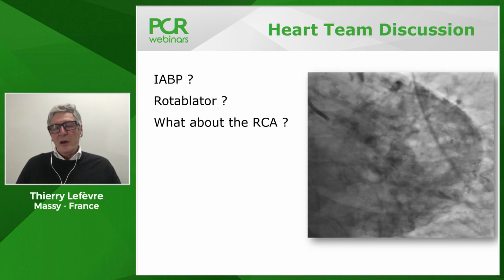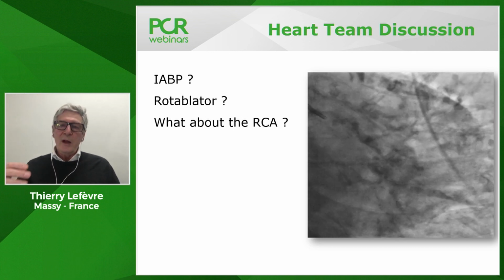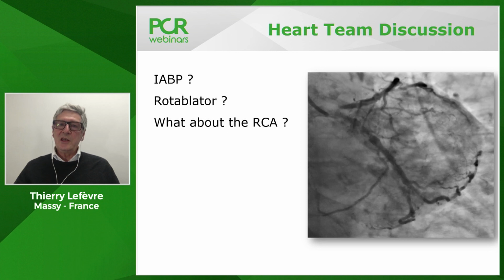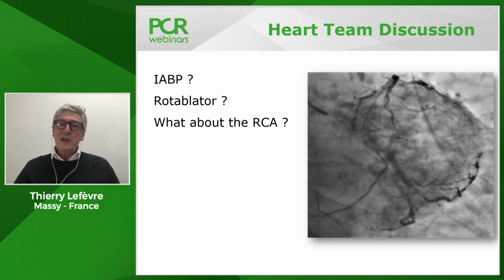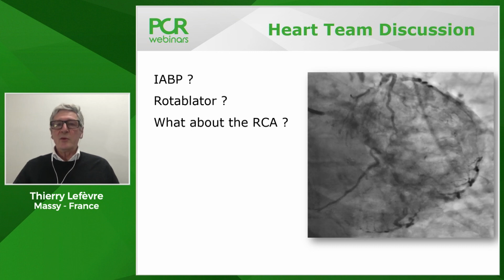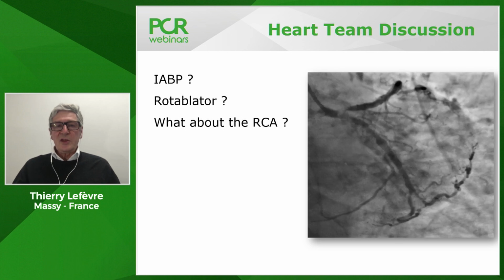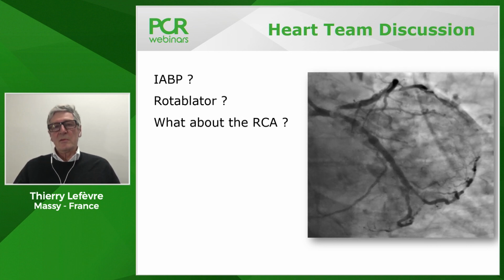Of course, you will not see everything, but when we start balloon angioplasty on this lesion, the pressure drops in 10 seconds from 14 to 5. So by using intracoronary imaging, we'll have the same problem. And of course, you need more time to do good imaging. So you can pre-dilate and do imaging, and then it will be safer. But starting with intracoronary imaging in this particular case may be dangerous.